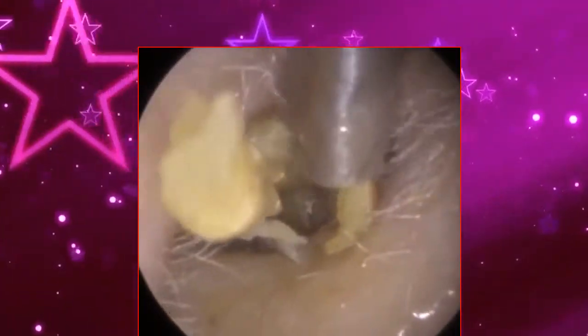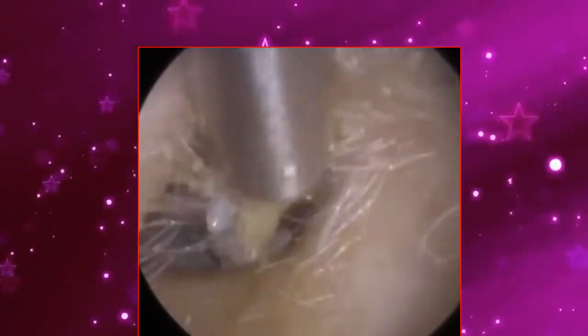The patient is really still, which always helps. So I'm rocking the suction tube up and down. You can see bringing this plug near the entrance. You can see the skin ribbons, it's all coiled. Dead skin is very elastic. It's got this spongy texture like a coil because the ribbons coil around each other. That's why I referred to it like a rubber ball earlier. A plug of dead skin in your ear, it's almost like a rubber ball.